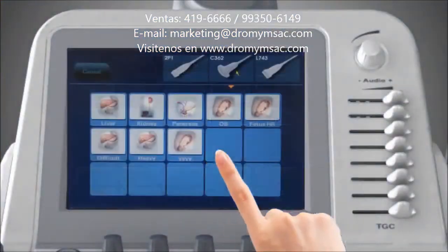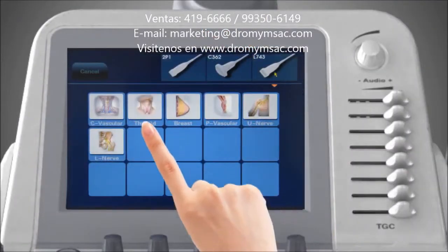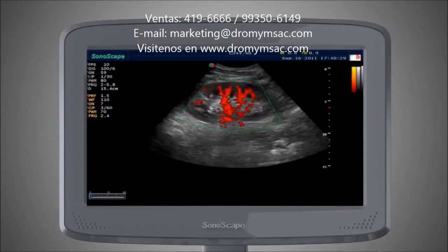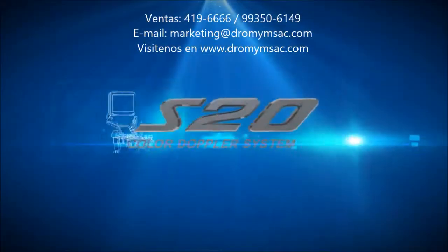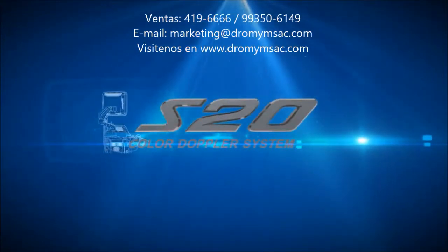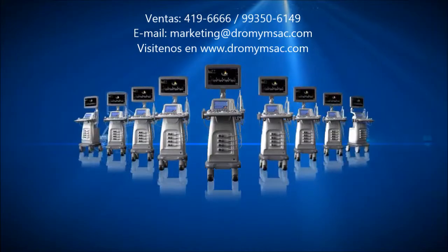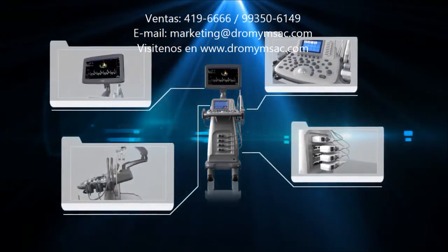Every S20 user can operate the system with ease. You can select and adjust exam modes according to your patient's condition. With a few simple steps, you can complete a fast and efficient scan. S20 has the best performance beyond the same class ultrasound, with multiple applications to meet different clinical requirements.